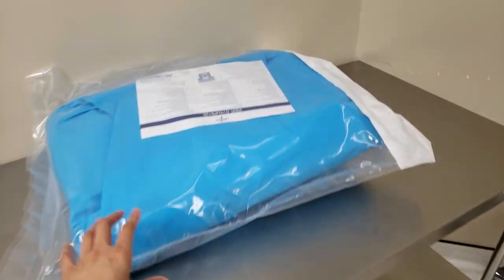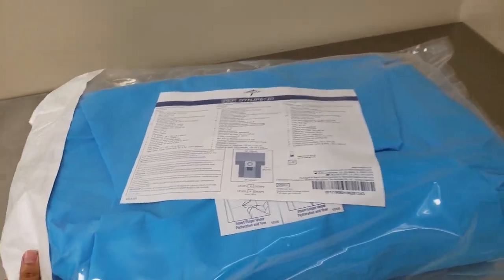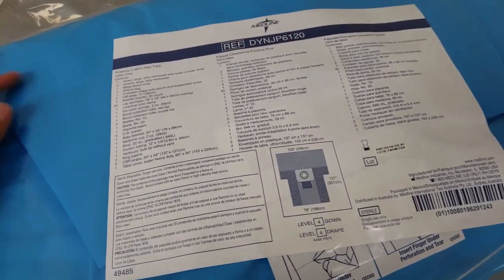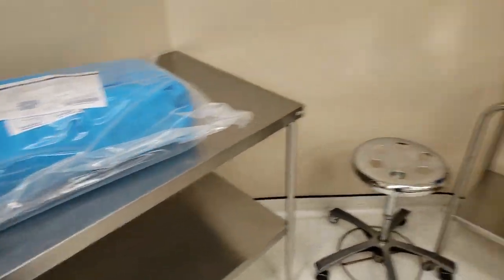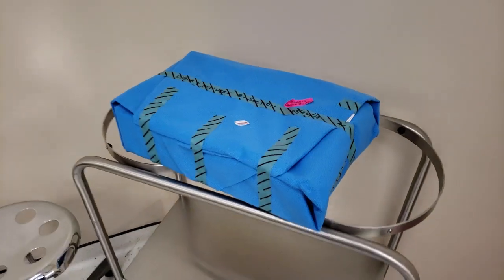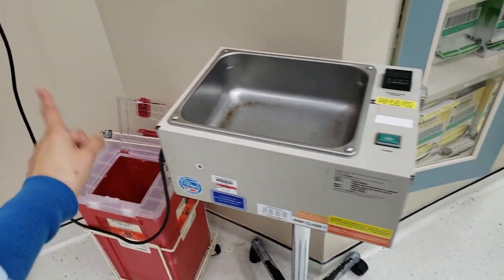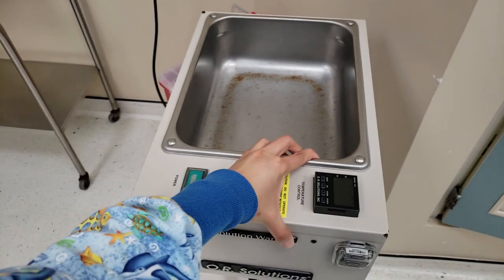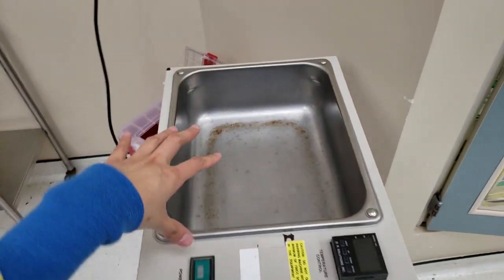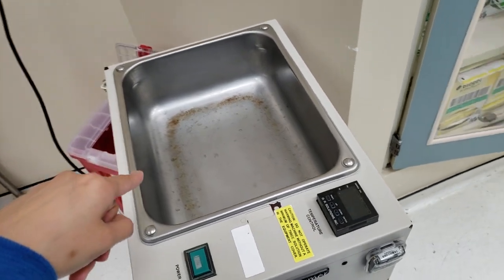This is the C-section pack that we have. I believe I've shown this in my other video where I broke down what was on here. So that's basically what we have. That is our C-section pack. That's the sharps container. This is the warmer. And so it goes like that. You drape this and then you turn it on when your nurse pours you the liquid.